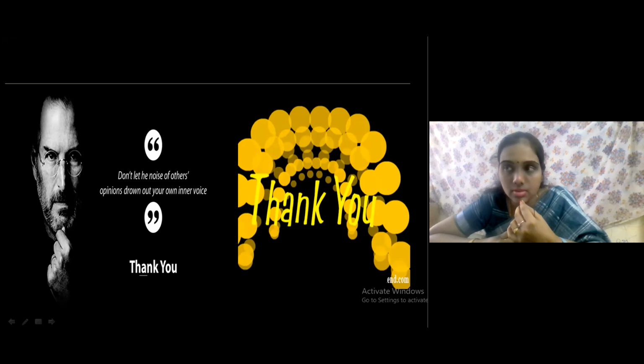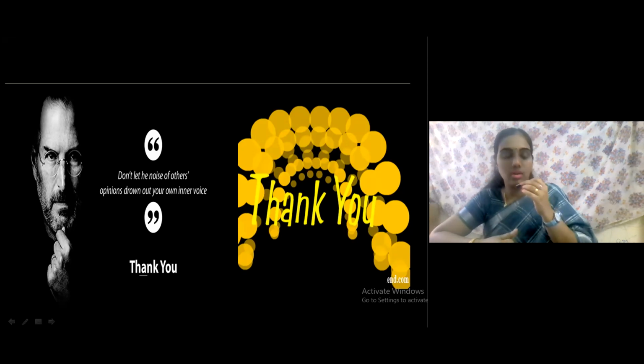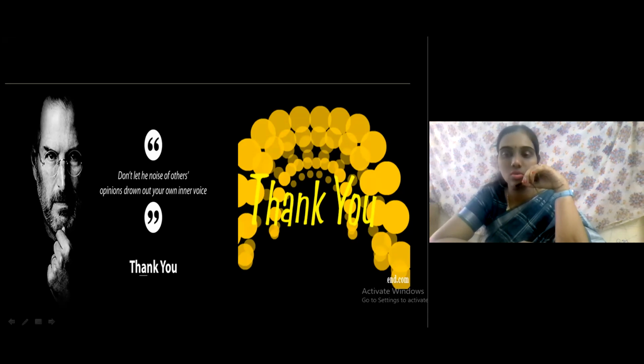Soft tissue CBCT, still there's no literature available for soft tissue CBCT. It is still under research. So it will be superior to CT, because when we also include soft tissue, the radiation is going to be more, but definitely not as much as CT. When we incorporate soft tissue CBCT, definitely it will help us more and aid us in our diagnosis and treatment plan.